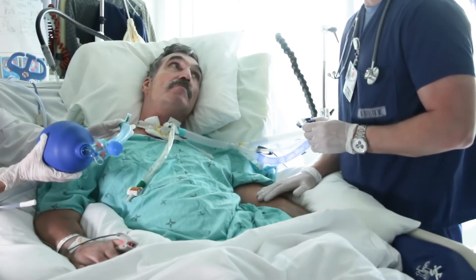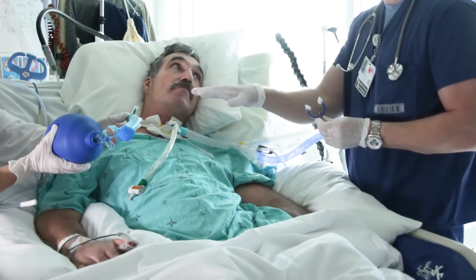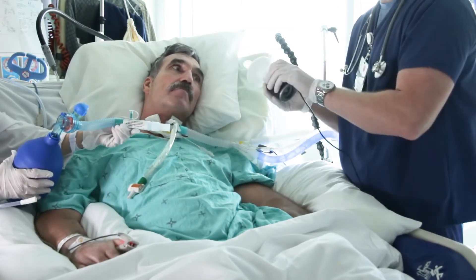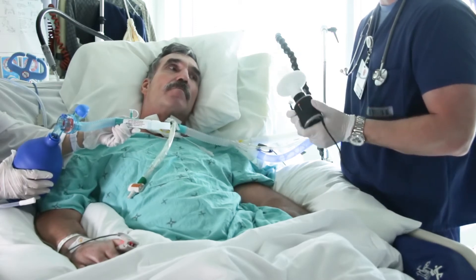Okay, great. Next we're going to measure your maximum insufflation capacity. So what we're going to do is we're going to give you breaths through the bag, we're going to inflate your lungs, and then when you're fully inflated, I'm going to put this mouthpiece into your mouth, and we're going to measure your volume coming out, okay, Greg?